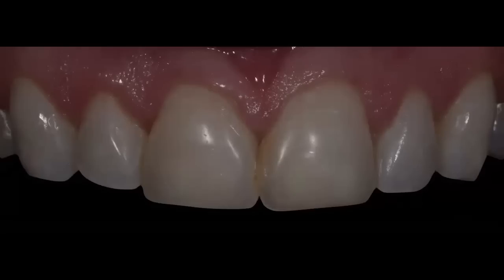So this patient came to us, and you can see that she had 2 composite veneers done on 8 and 9. Not only that, the shade most likely wasn't a good match. These have been there for some time, so they're not new restorations. They were there for many years. But right now, you can see that they don't shine as much. They don't have a glossy surface anymore.